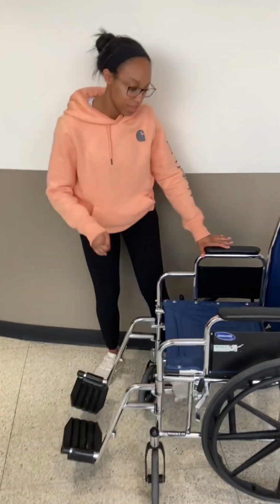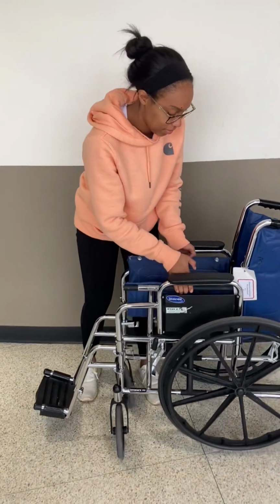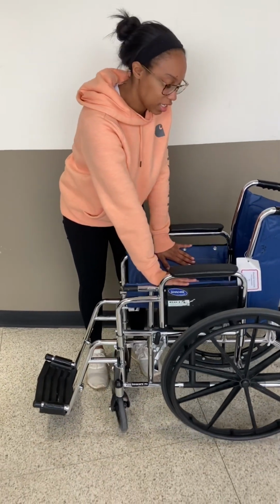And then when it comes to putting the wheelchair away, you're going to want to grab the sides and pull up. So now it's all compact. And to open it back up, you're just going to, at the sides again, just push down.